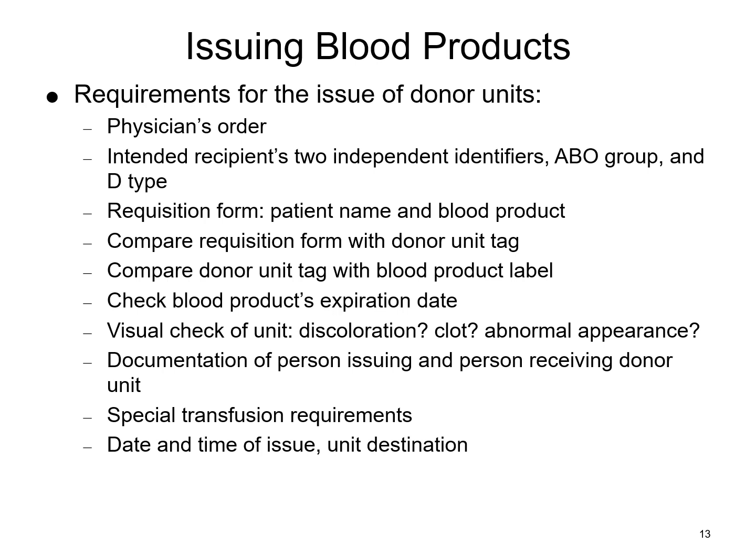So whether it's in the computer or a signature on that requisition, somewhere you have to document that you are the one that did the inspection and issued it, as well as the person that is requesting it. They have to have signed for it as well, because they're basically stating, yes, I'm ready to give this product, I'm here to get it, send it to me, let's go. So they've acknowledged that they're ready to give it, because you have that short window for these products to be transfused.